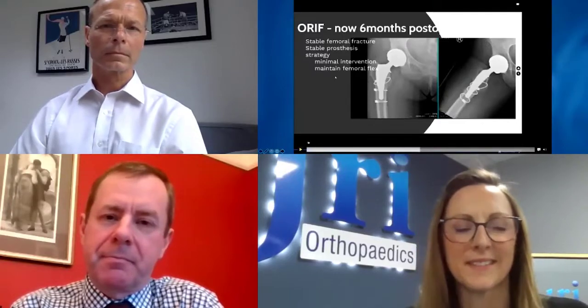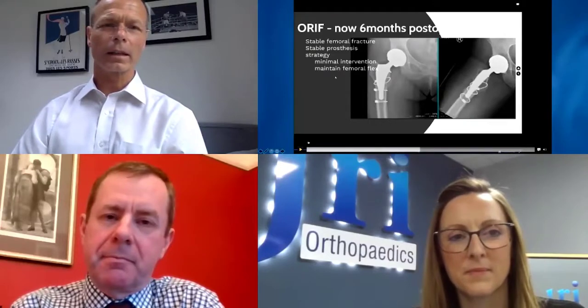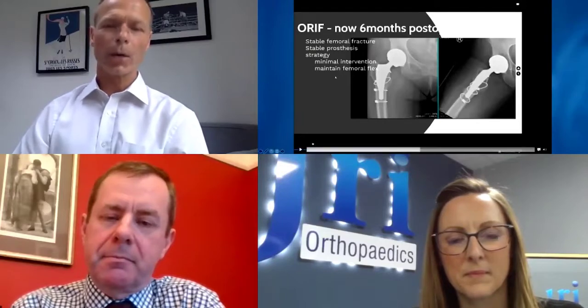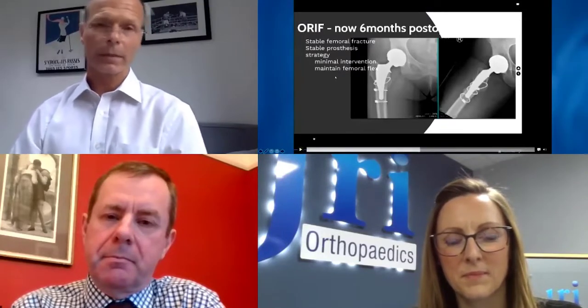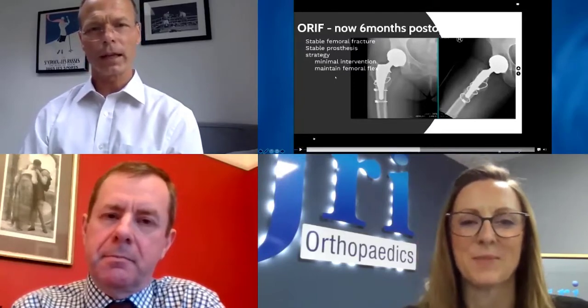Do you agree, Johan? Yeah, so what I was going to say, I would get a CT scan just to assess the fracture pattern exactly and get a feel for the stability, but I would have been hoping to do a cerclage wire for that. It did look very stable, and I think you can get away with it. Yeah, so I think that's what I would have ended up doing, having reviewed a CT scan.